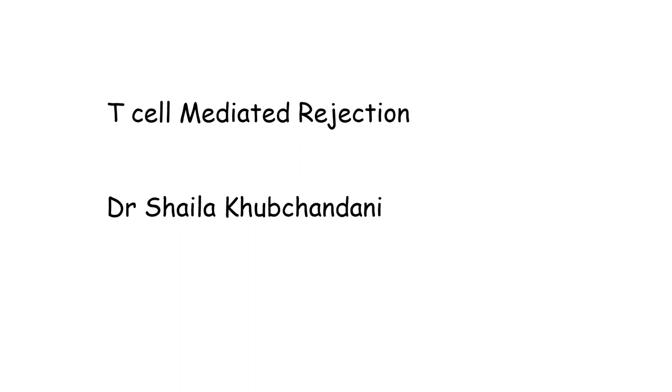I'm going to be talking to you about the morphological aspects of both T-cell mediated rejection and humoral rejection. I'll begin first with T-cell mediated rejection.